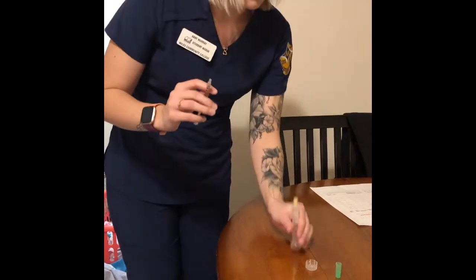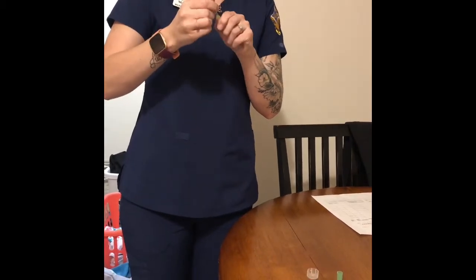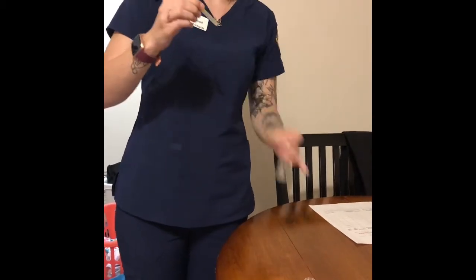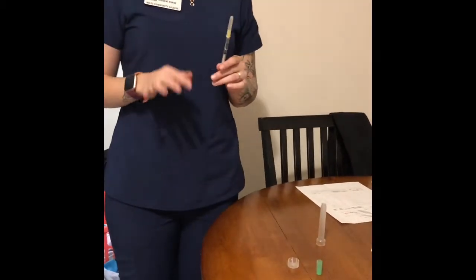And then you want to put your needle back on. Not like that. Okay. Your needle back on, and you're just touching it at that hub there. Now you are good to go see your patient.